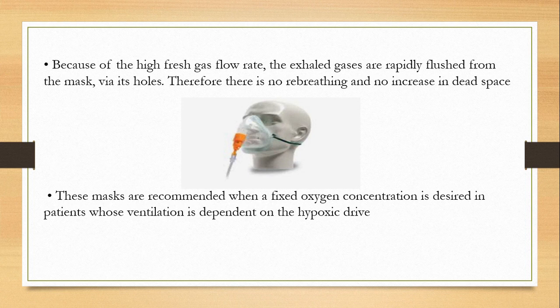Because of the high fresh gas flow rate, the exhaled gases are rapidly flushed out from the masks. So there is no rebreathing or retention of carbon dioxide in this device. These masks are recommended when a fixed oxygen concentration is desired and ventilation is dependent predominantly on the hypoxic drive of the patient.